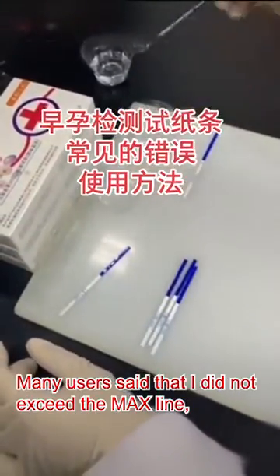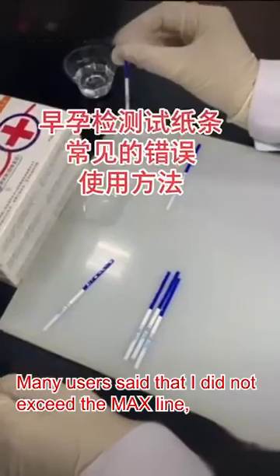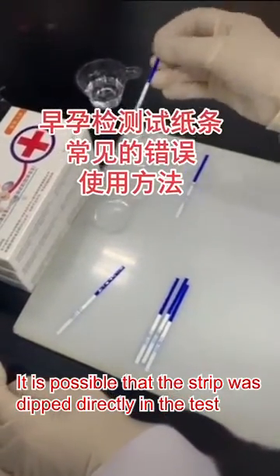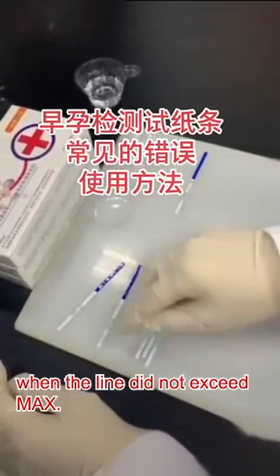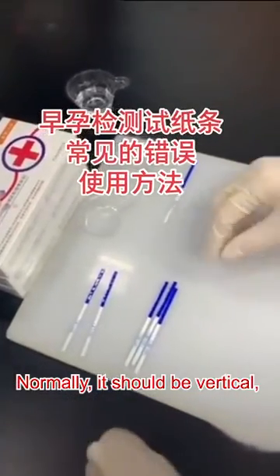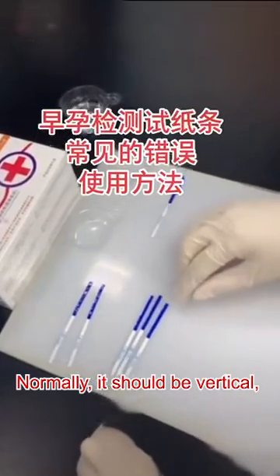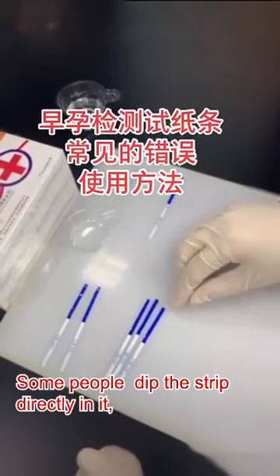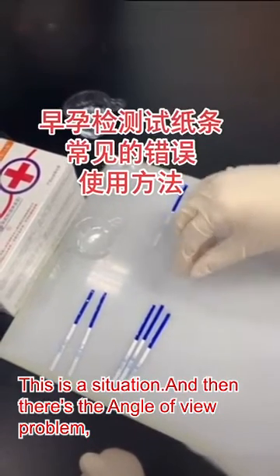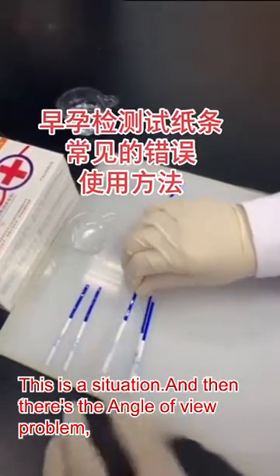Many users said that they did not exceed the max line. What might happen to them? It is possible that the strip was dipped directly into the test when the line did not exceed max. Normally, it should be vertical, and then it enters the liquid for detection. Some people dip the strip directly in, and the liquid level has exceeded the max line. This is one situation. And then there's the angle of view problem.